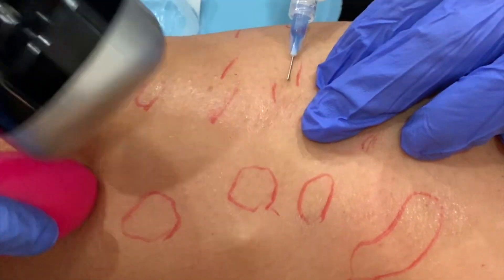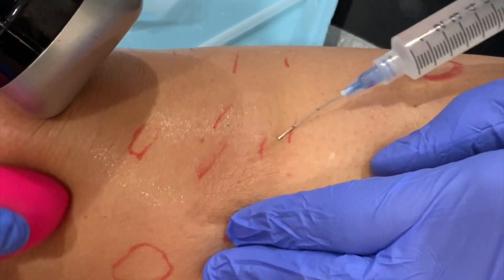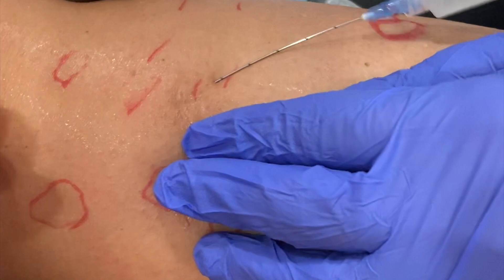Occasionally this is associated with bruising, but not often because cannulas are used. I stay in the most superficial plane in the subcutaneous tissue and scrape along the undersurface of the skin.